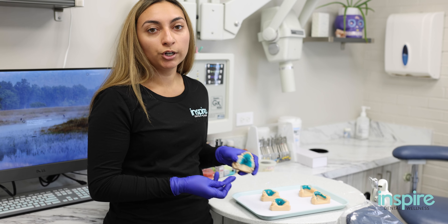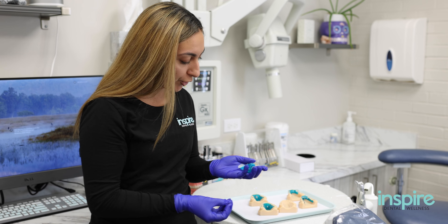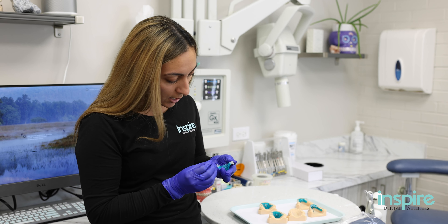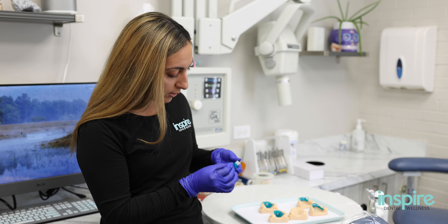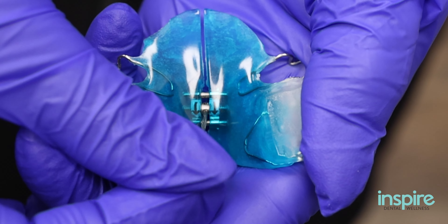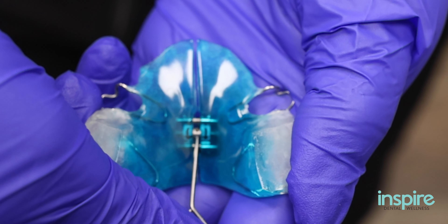You always want to turn the expander in the direction of the arrow. You'll have the expander in your hand — you're going to turn outside of the mouth because these are removable expanders. I'm going to put the key in the middle hole and I'm going to turn down 45 degrees, take it out. That's one full turn.